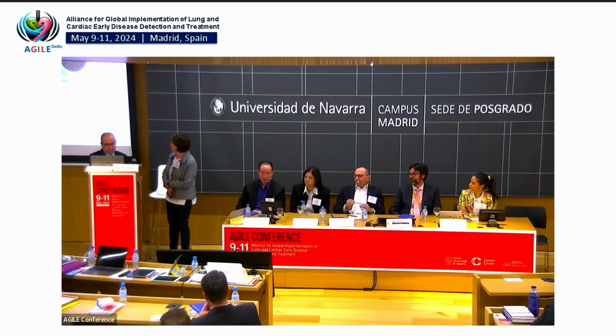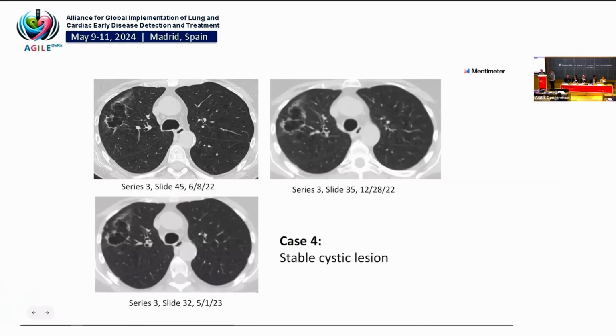Okay. So here we have, I have it in one of the next slides, but I would like to say now that in I-ELCAP, we knew about these atypical cysts more than 10 years ago, right? In 2012, there is an article which I will show you, with Ali as the first author, about the atypical cyst, but it was only introduced into Lung-RADS in 2022.